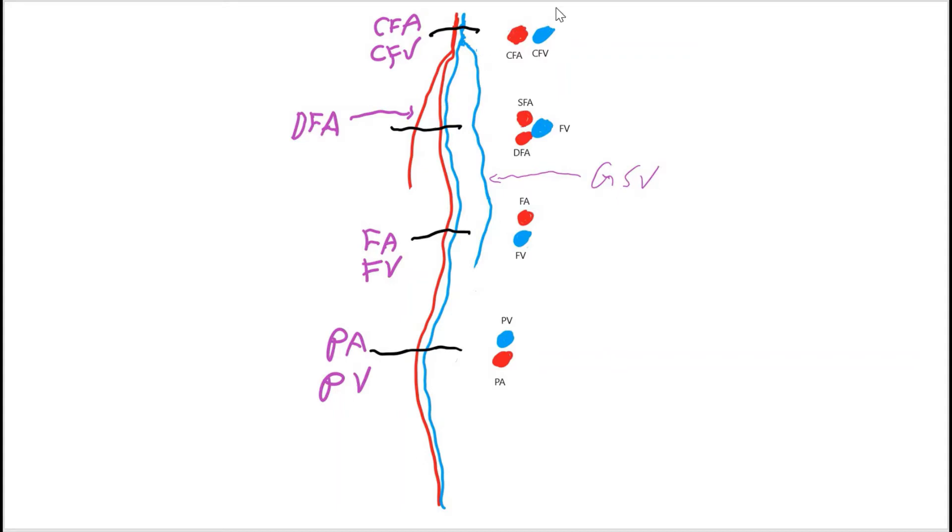On the right side we see what the vessel looks like on a cross section area on the ultrasound. Black is where the ultrasound beam is hitting. Here the red is artery and the blue is vein. So at this spot we have common femoral artery, common femoral vein, and you'll see two black circles on the echo.